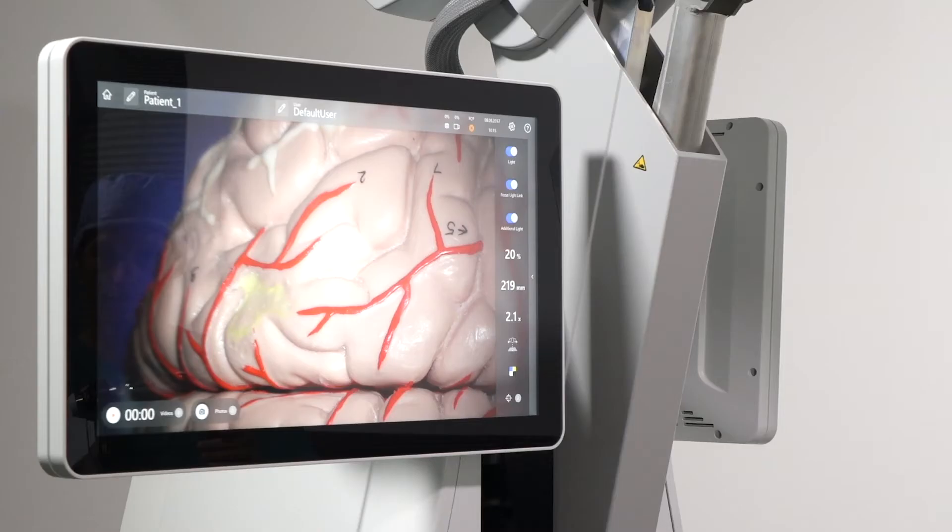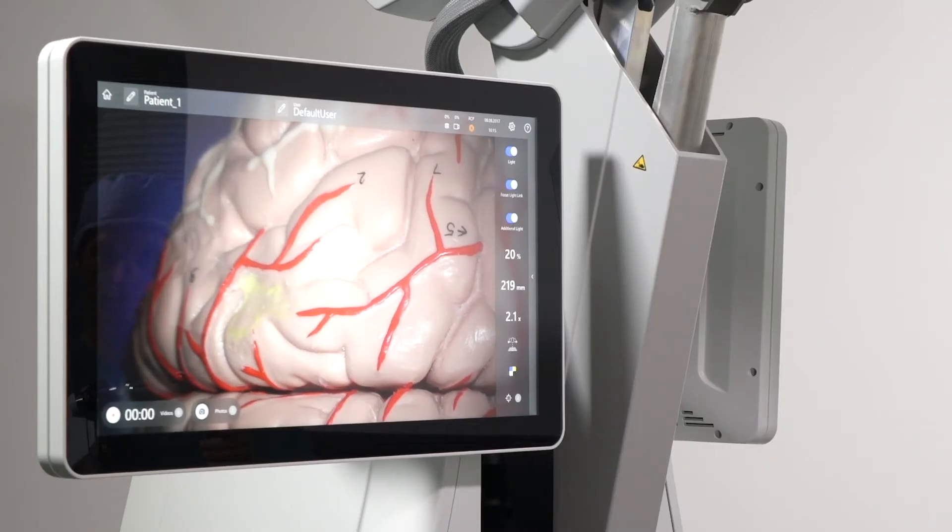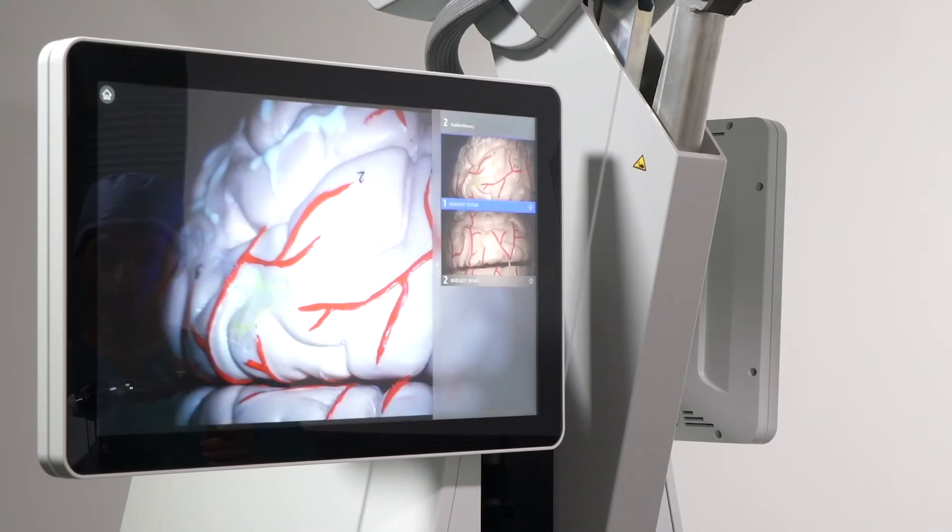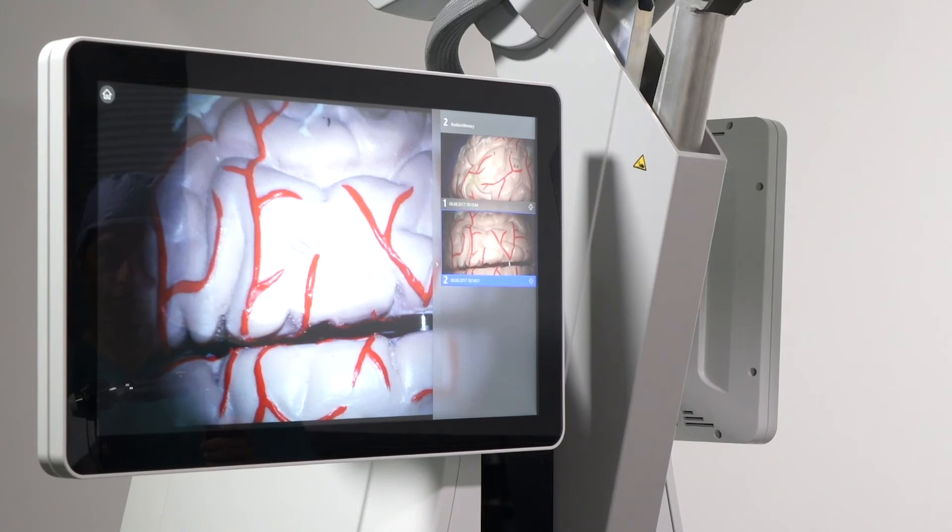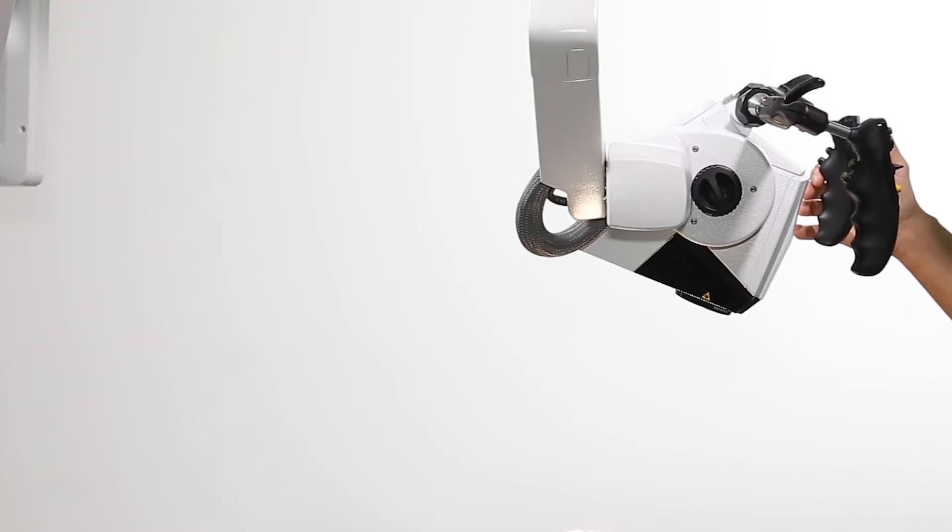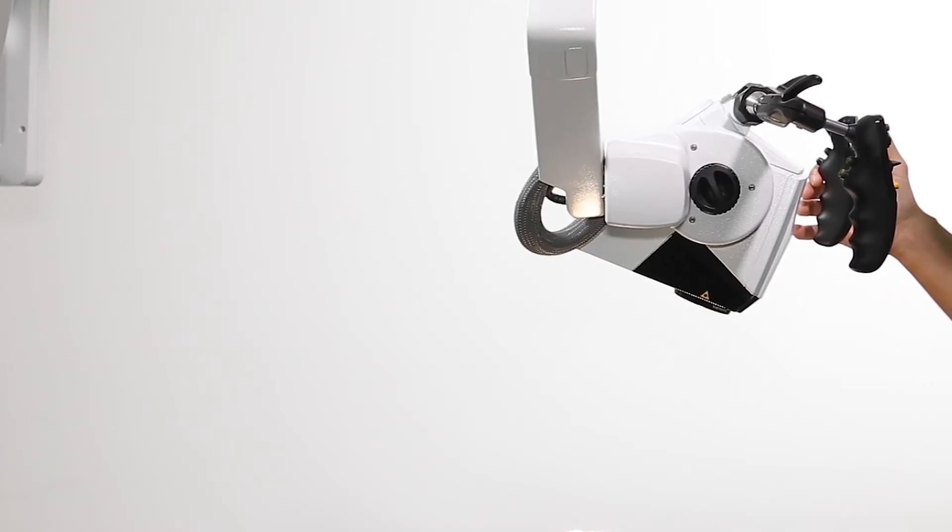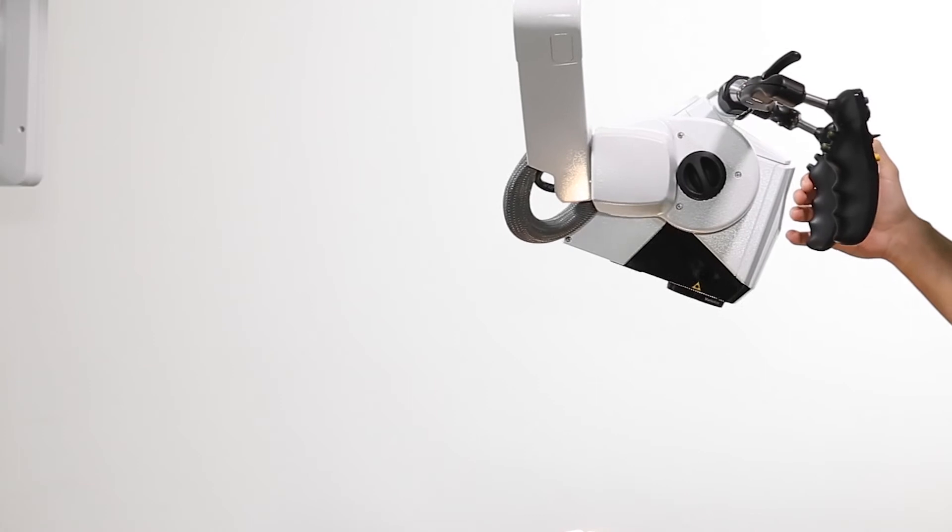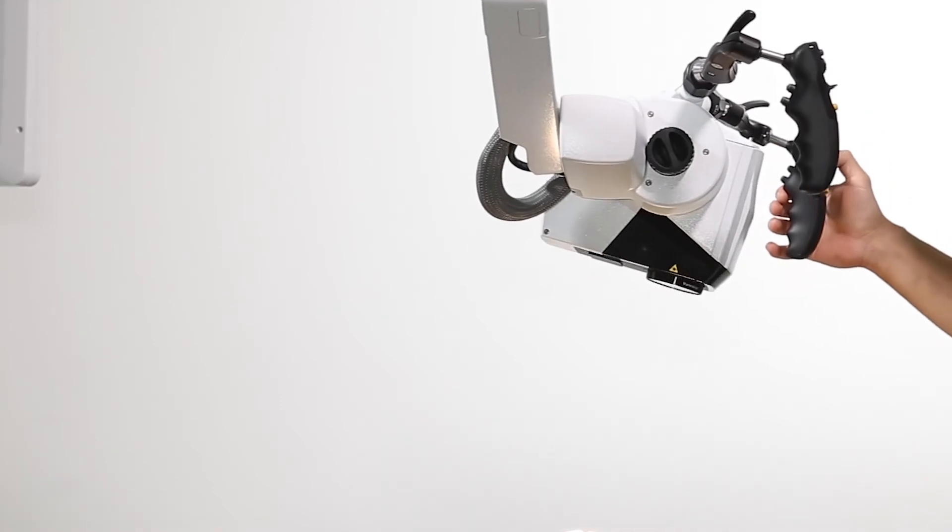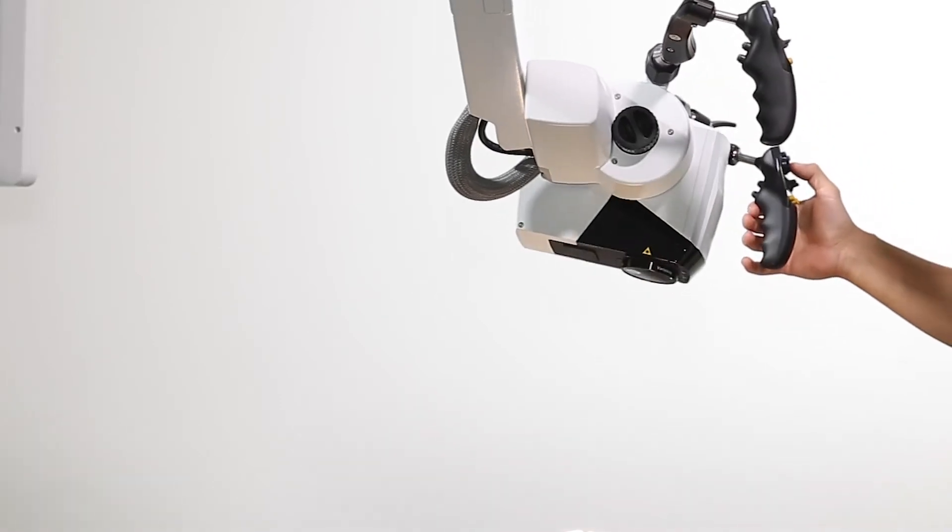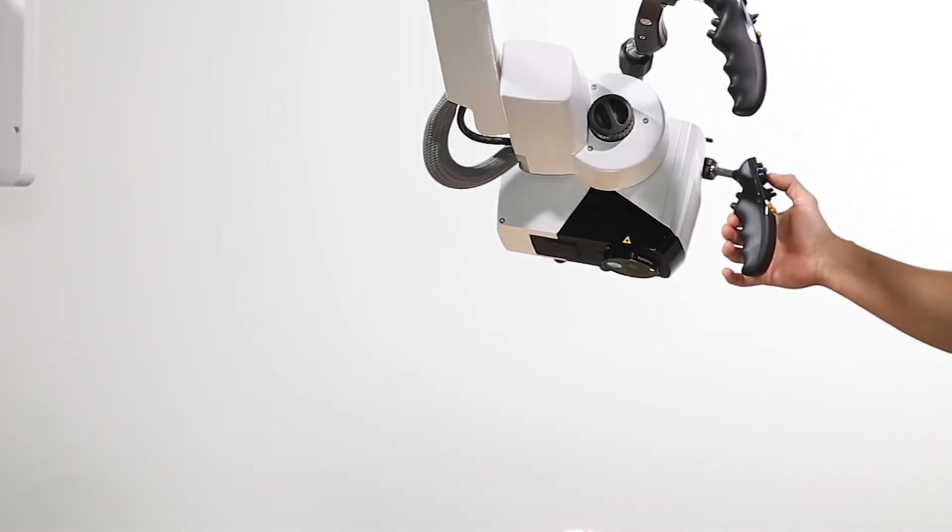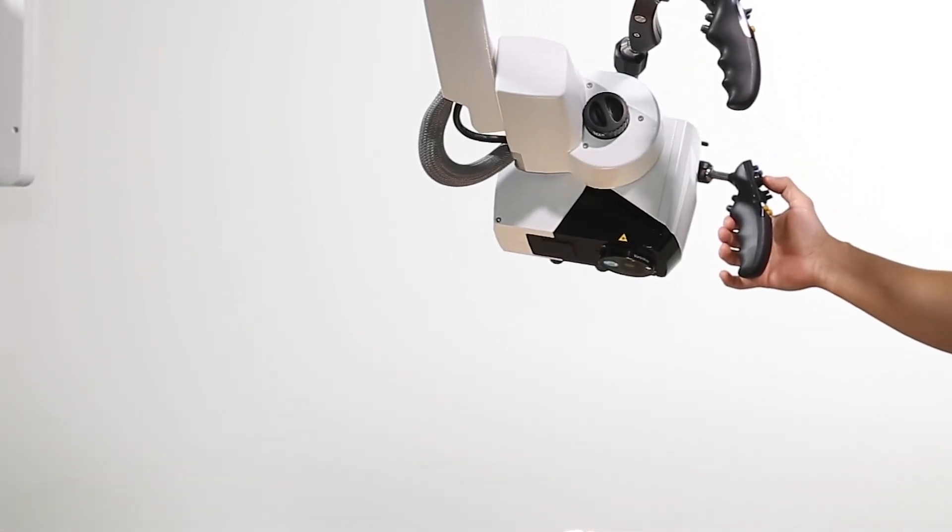To recall, press the same button for 3 seconds to view all stored positions. Select the position you wish to recall using the joystick. Activate auto movement by pressing the joystick on the right handgrip to the right. The bing sound indicates that the position is attained.